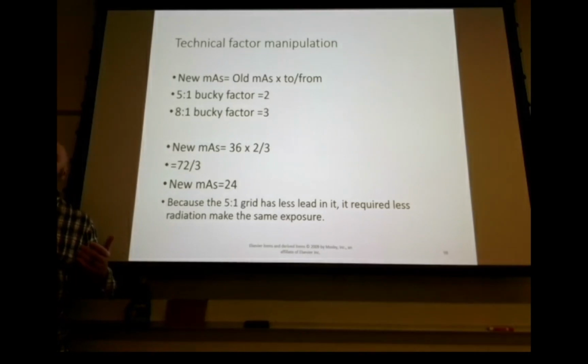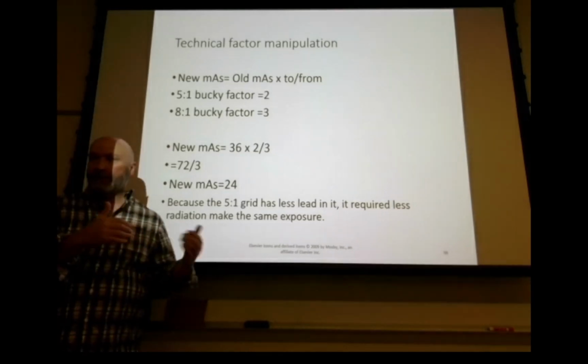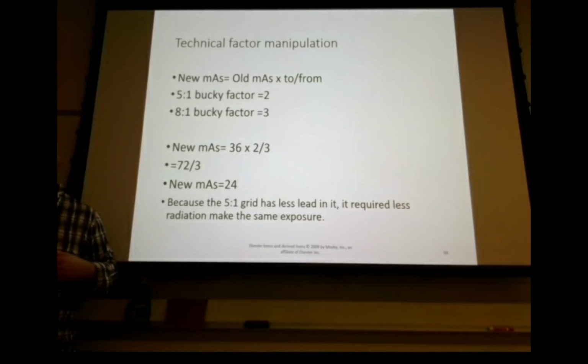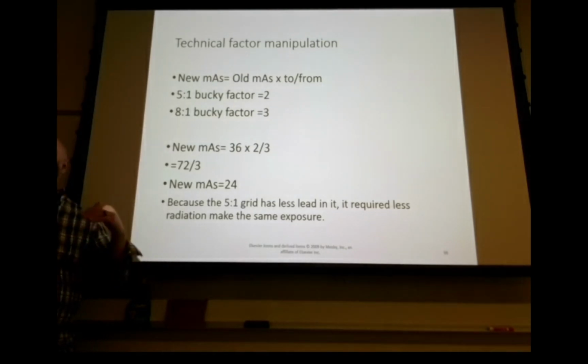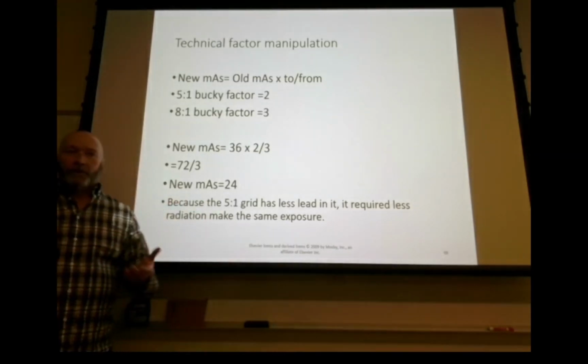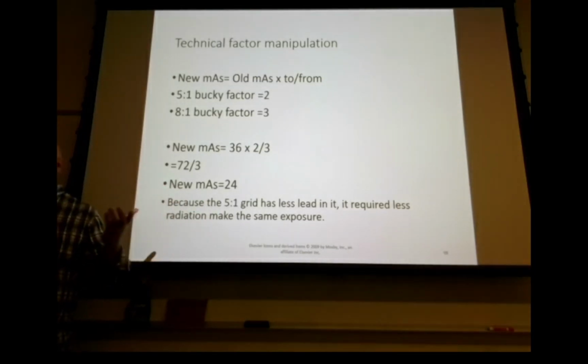It says, okay, that's too low, that has to be scatter radiation. 10 kVp, that lower end of the beam spectrum should have been absorbed inside of the patient. If this came through the patient, it's scatter radiation. So it just disregards it. So it does take the number of photons, and it reduces the number of photons in the calculation of your exposure index number, which means that you have to drive up your mAs still.